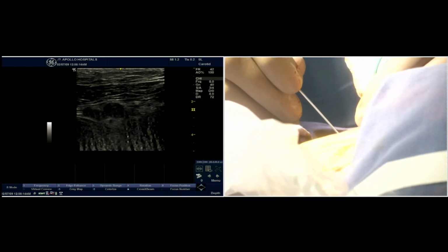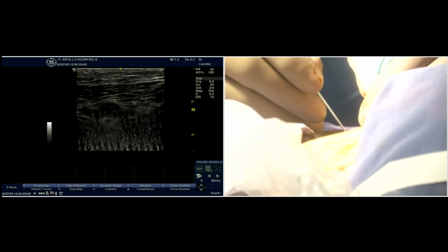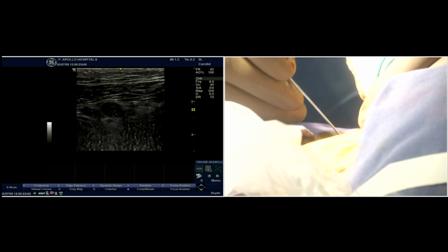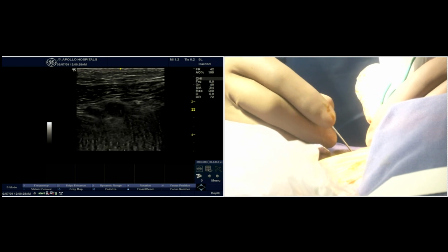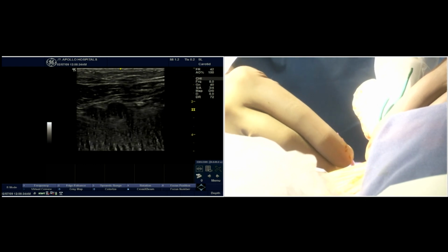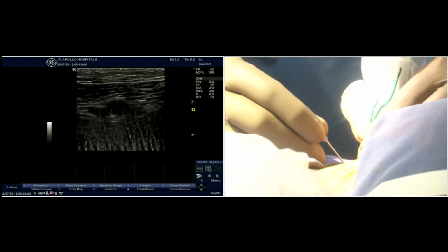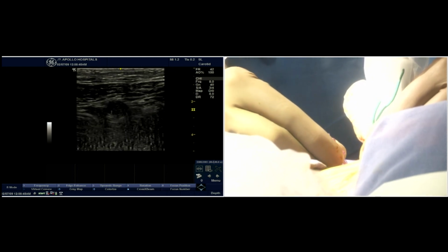Yes, we can see the ultrasound, and we can see you. I am just going to keep the center of the probe here. Yeah, it's coming there. So it's a nice single operator technique. The left hand is holding the ultrasound probe, and the right hand is obviously using the needle. And you'll just see the track of the needle coming now. You can see a little bit of disrupted movement in the subcutaneous tissues there. Just approaching the vascular lumen now.